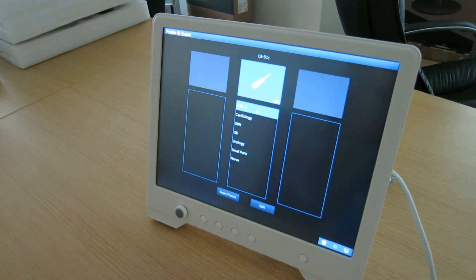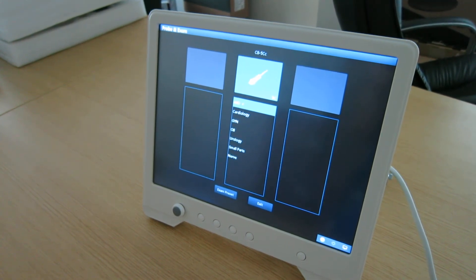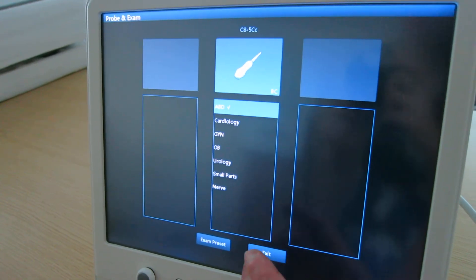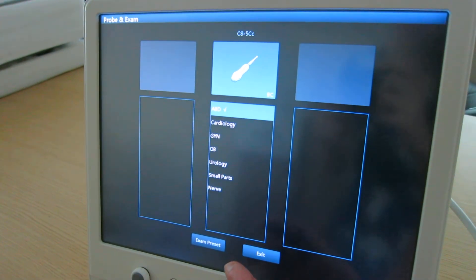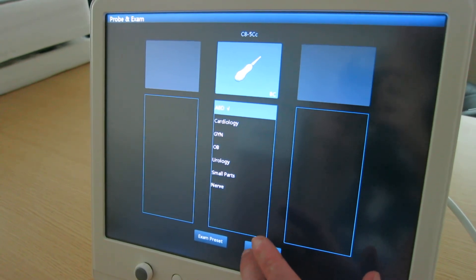The function has different settings — cardiology, gyno, small parts, nerve — for different scanning techniques, able to preset an exam as required for your practice.